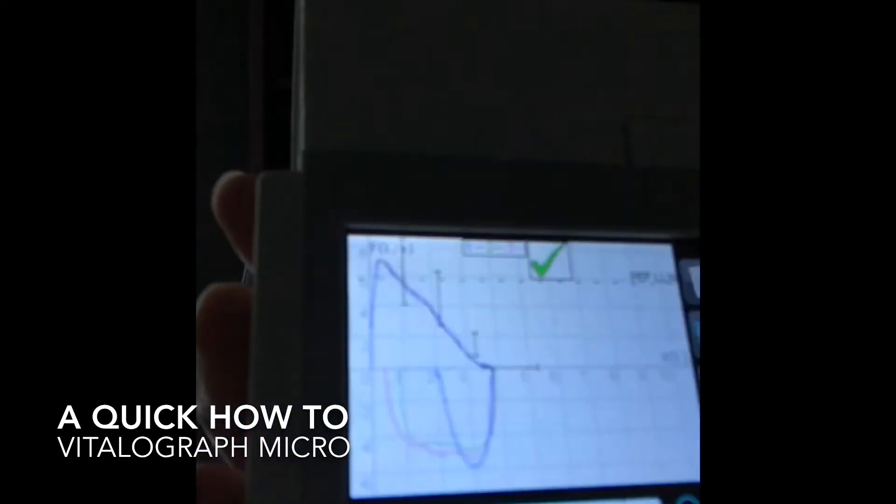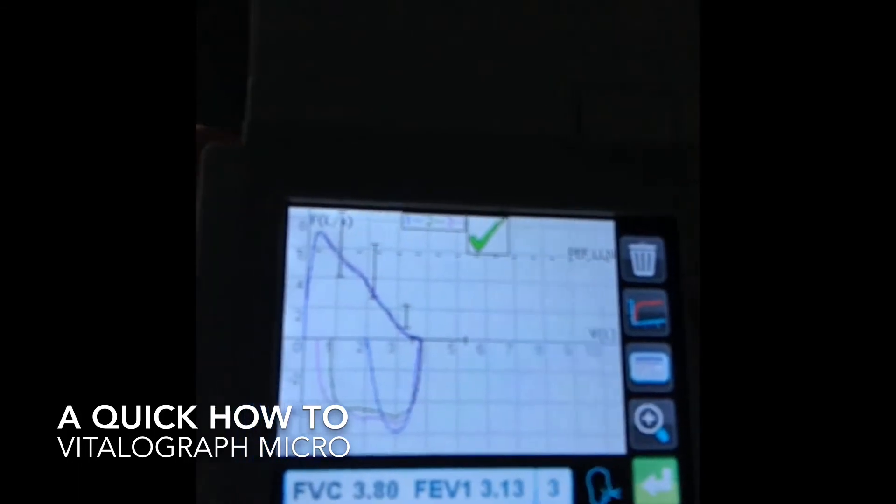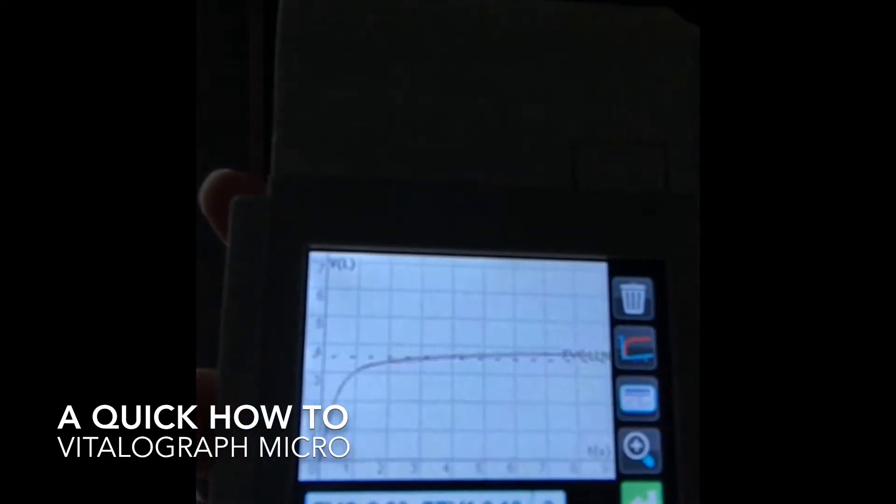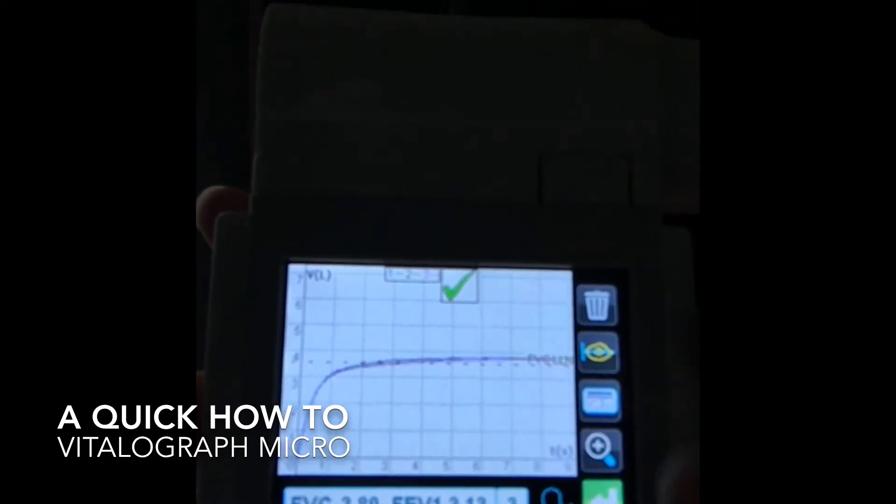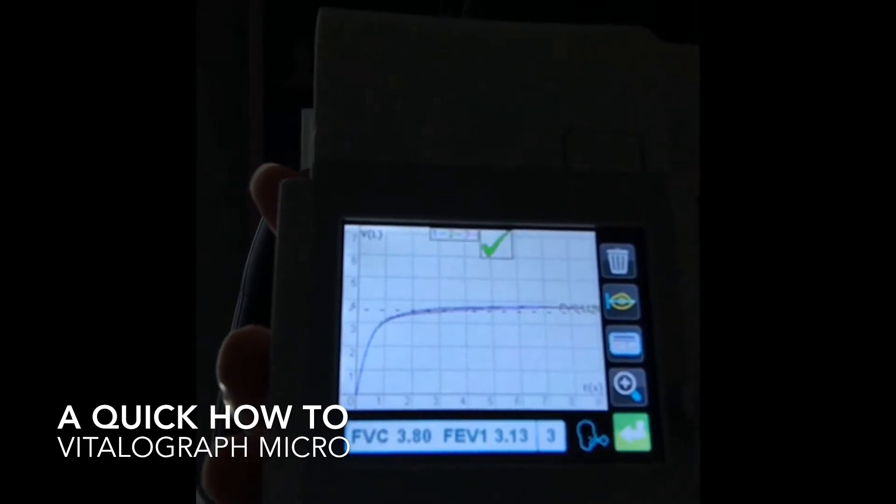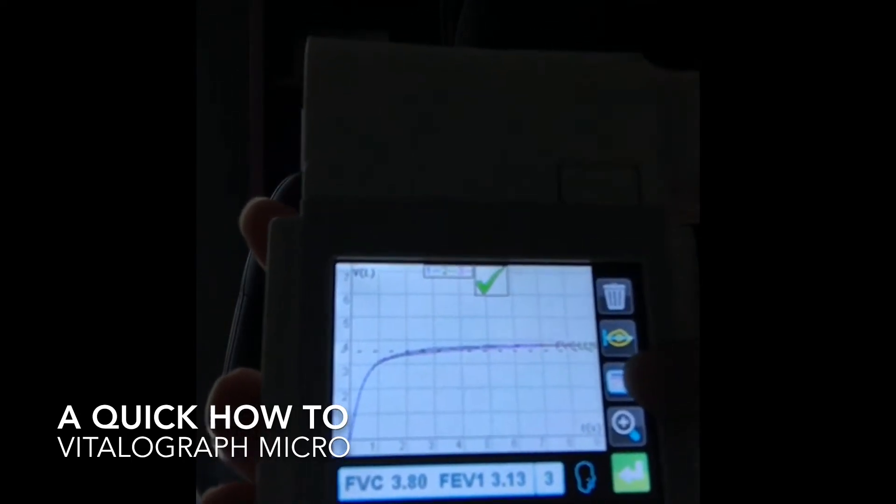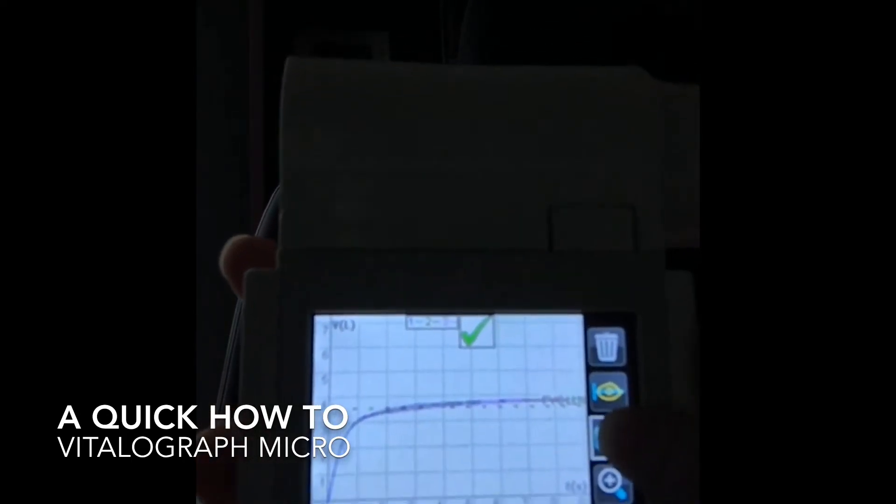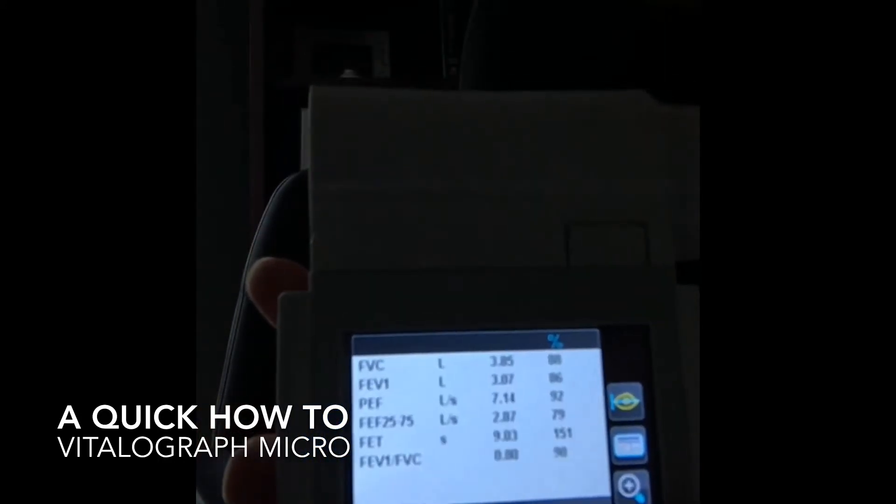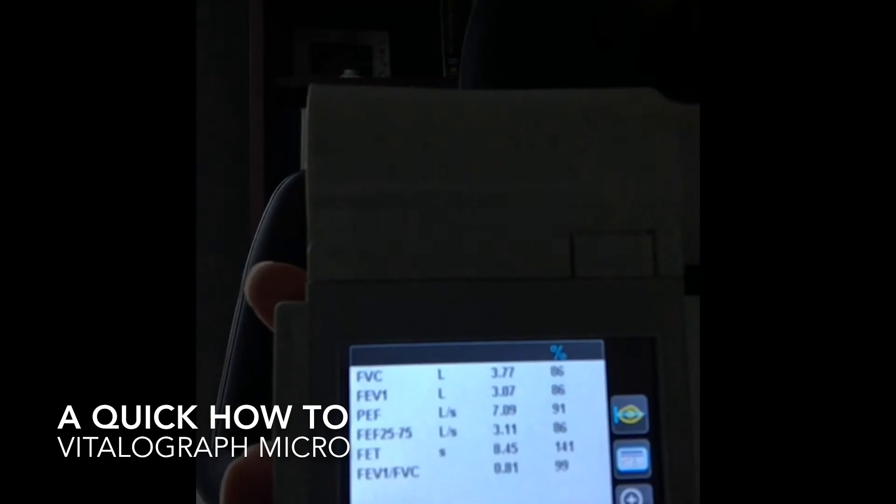Now, if you want to look at the specific components of each loop, I have effort number three selected here. So you can click here, look at your volume time. I'm going to make sure that you overlap, that you overlay nicely there. That indicates that we have some consistency. And then you select this button here. And that will allow you to toggle through the numeric values of each of your tests.